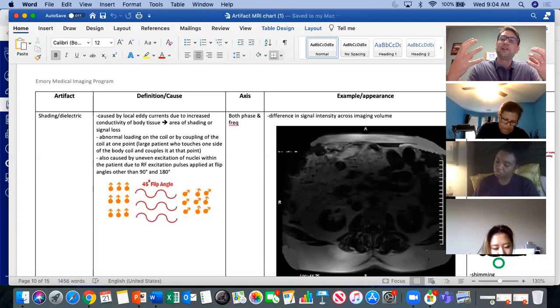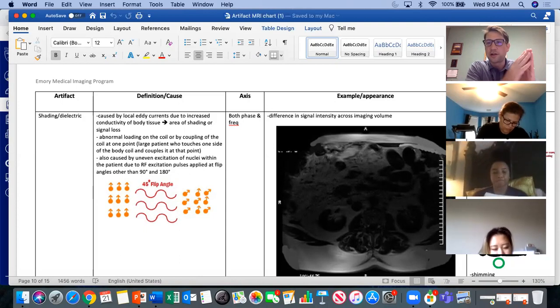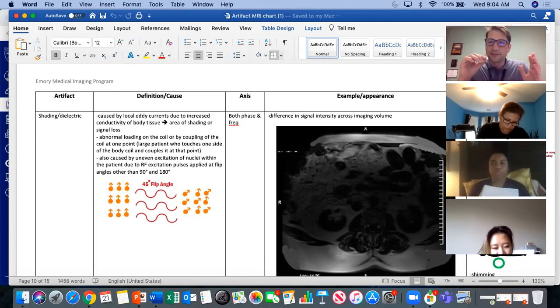If there is any electrical charge, it's not going to move; it's going to impede an electrical charge. If an electrical charge comes up against fat, it's just going to stop, and that's where it can cause burning sometimes. So if you're scanning an area that is more conductive, like muscle, you might get more of these artifacts.